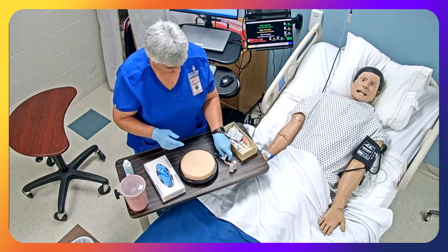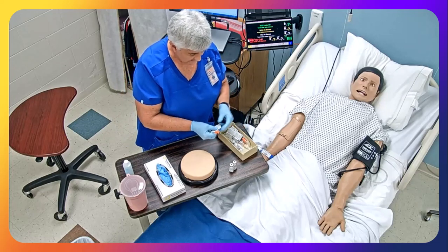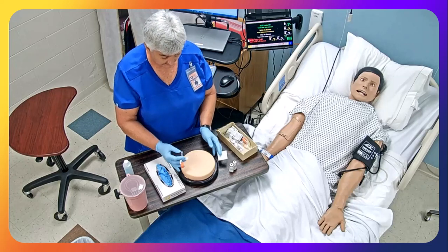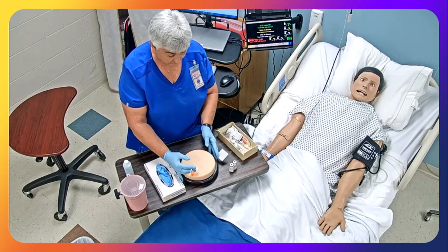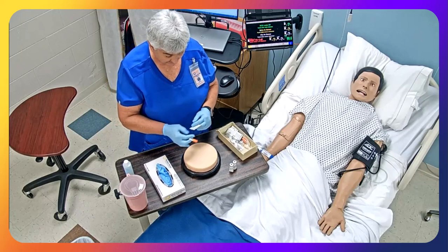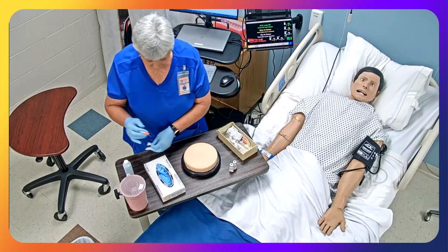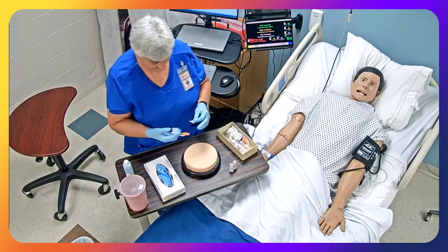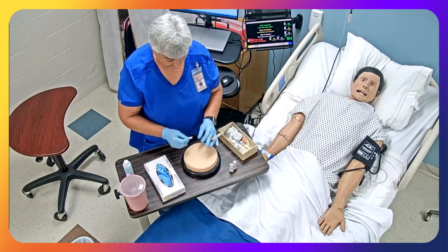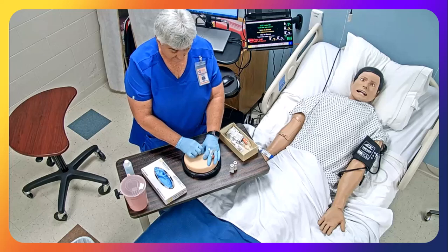Okay. All right, so I've got my insulin, and because that needle is so small, subcutaneous can be at a 45 to 90 degree angle, but it's recommended for insulin to be given at a 90 degree angle. And so we're going to go ahead and, so I'm going to put this over here in this hand right here. And I'm going to pinch up. We're going to work in a circular motion.